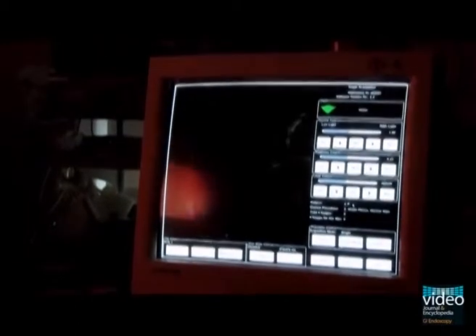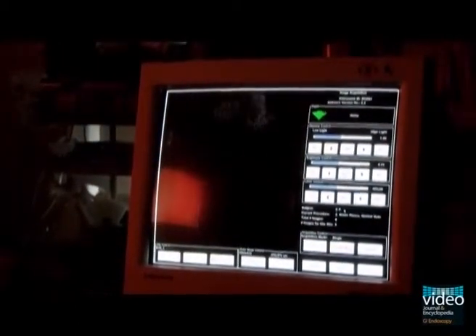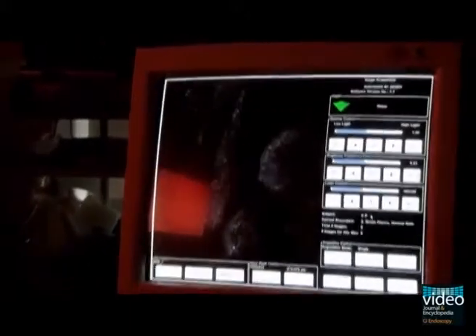Suspicious white light lesions are placed within the confocal imaging window. The endoscopist then looks at the confocal laser endomicroscopy tower monitor to interpret the images. Using the foot pedal, the endoscopist can capture still images of the endomicroscopy. These images can then be used to determine the need to perform a forceps biopsy.